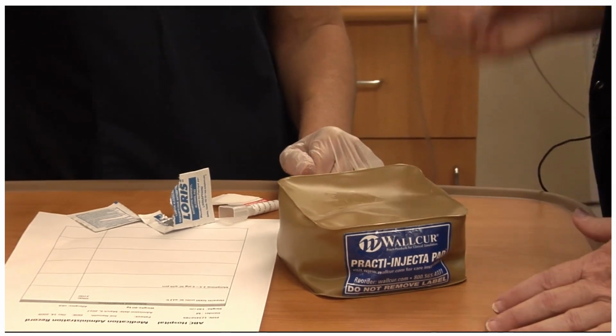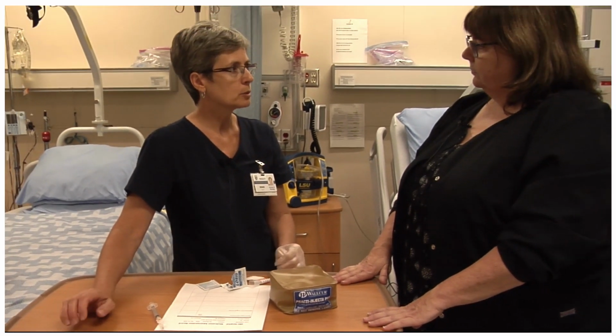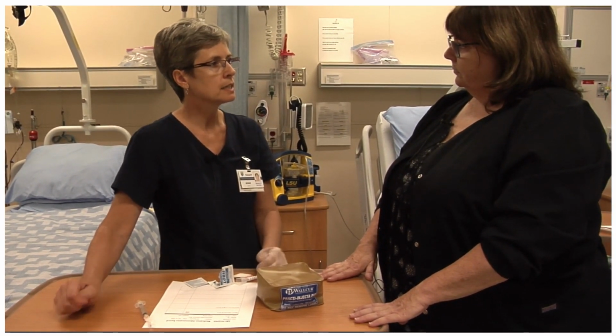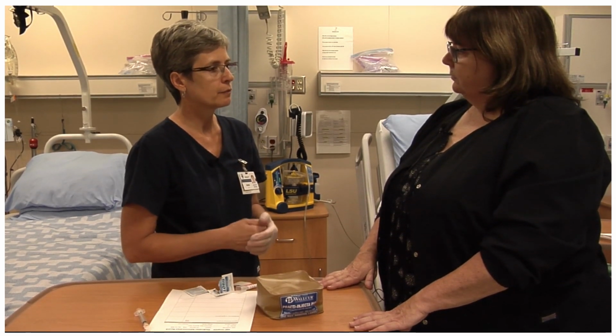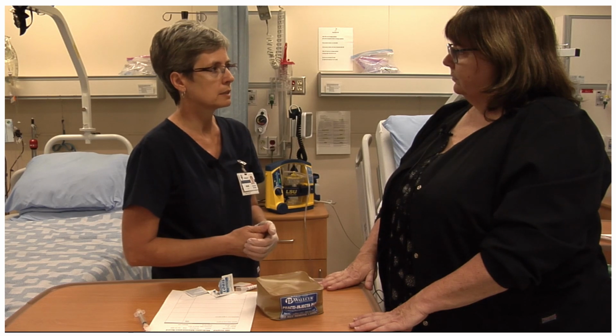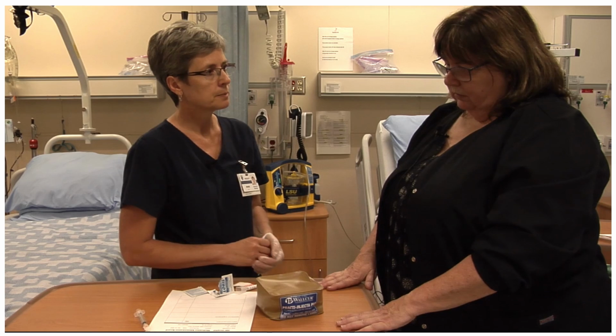Okay, and a 45-degree angle? 45-degree. If somebody has a lot of subcutaneous or adipose tissue, you could go 90 degrees. That takes some skill level and some experience after seeing lots of different bodies and body masses. Okay. And then following it, we will chart.